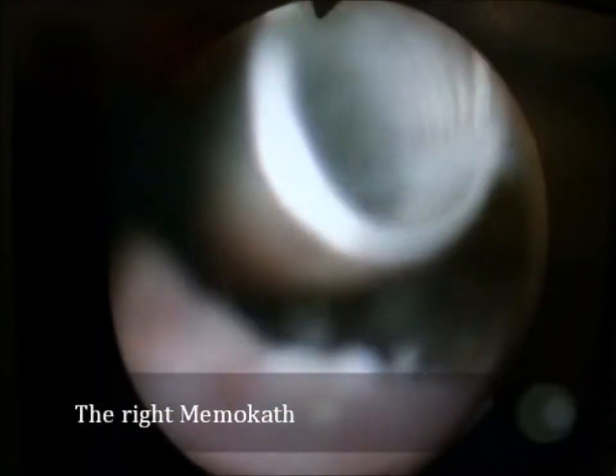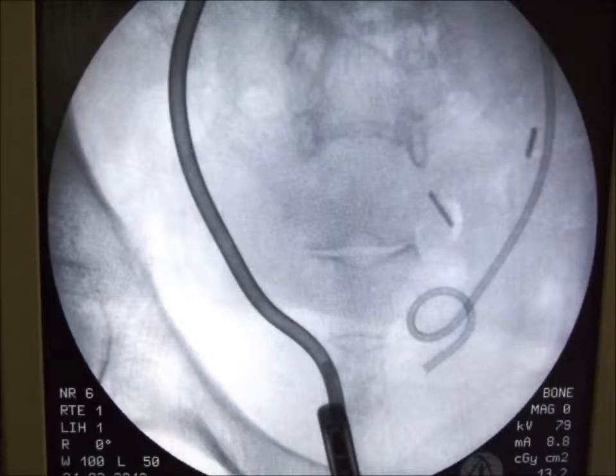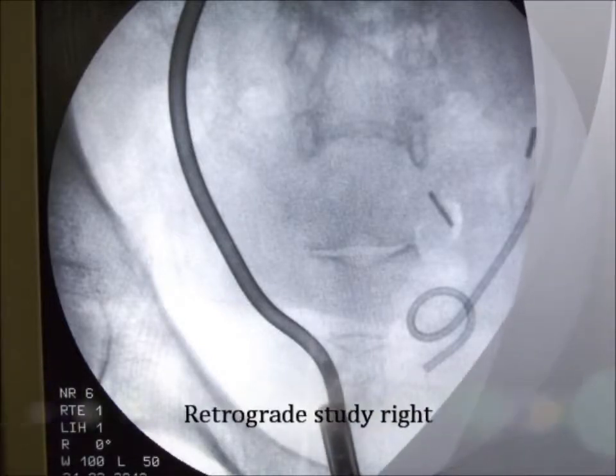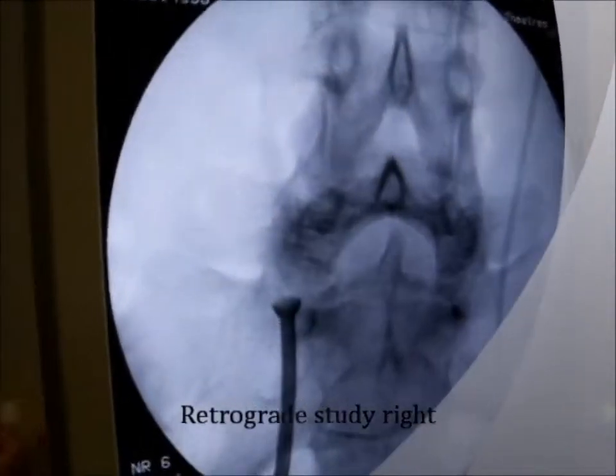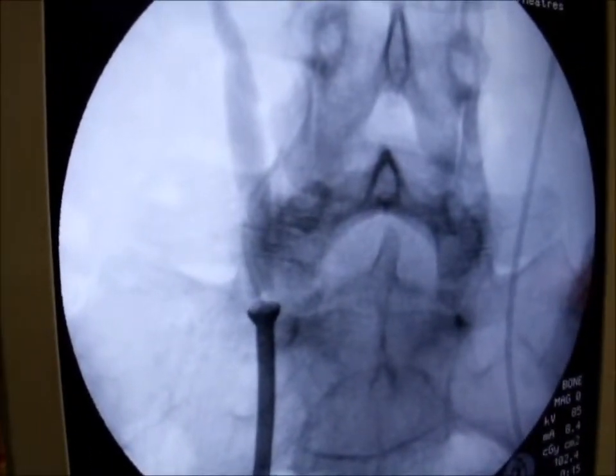First, the right side is inspected. After four months, the nitinol stent does not show any encrustation, despite the distal end slightly protruding into the bladder as intended. Retrograde ureterography confirms the patency of the stent.